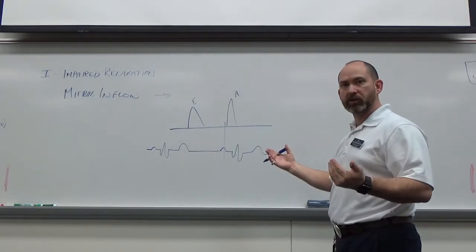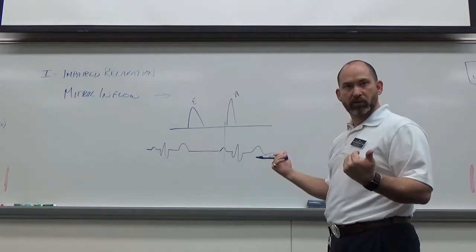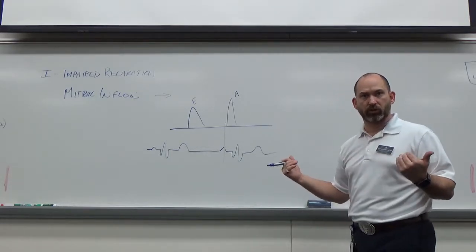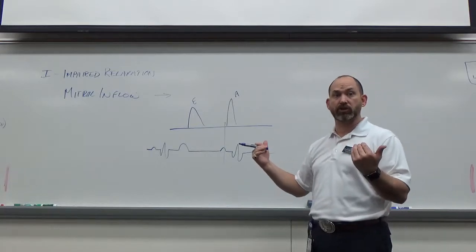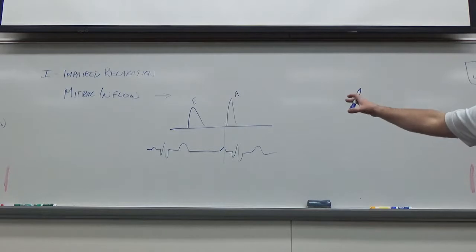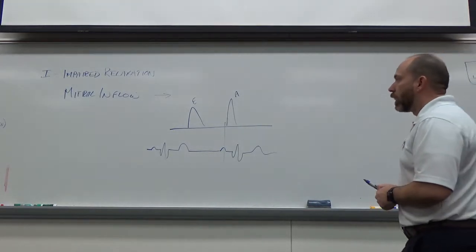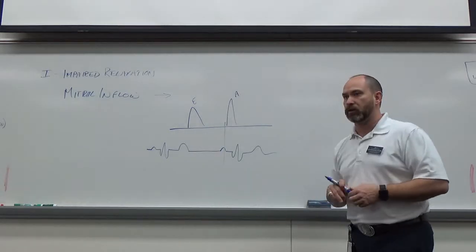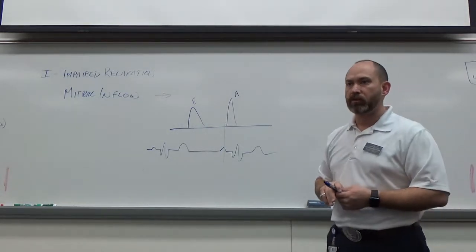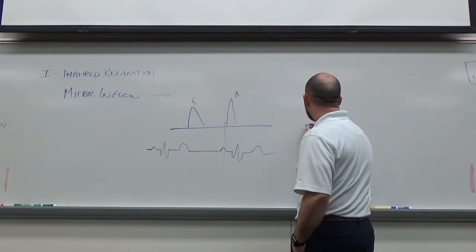what would Valsalva do to this? It just presses both of them down the same ratio. So it doesn't change anything as far as their relationship, it just pushes them all down because of increased pressure. So I'm not going to drop Valsalva because Valsalva doesn't really do much at this phase. What's our next one on the line usually? So tissue Doppler. Okay, so what does our tissue Doppler now look like?